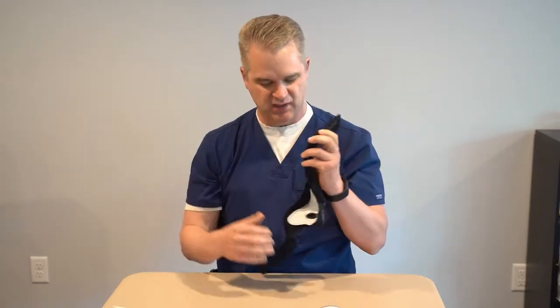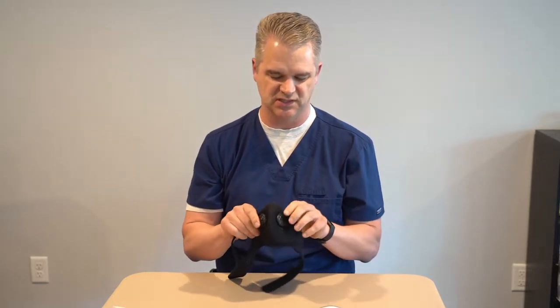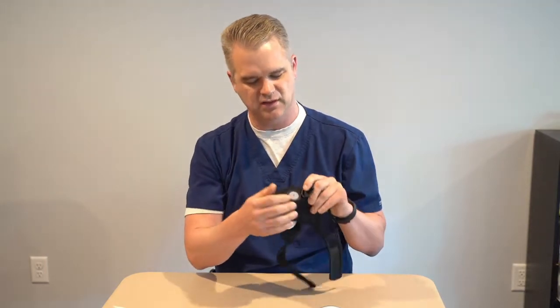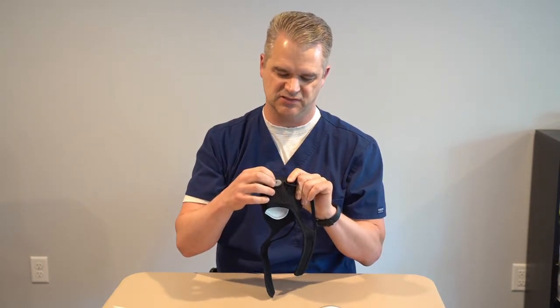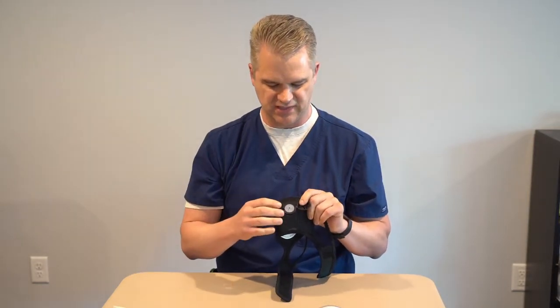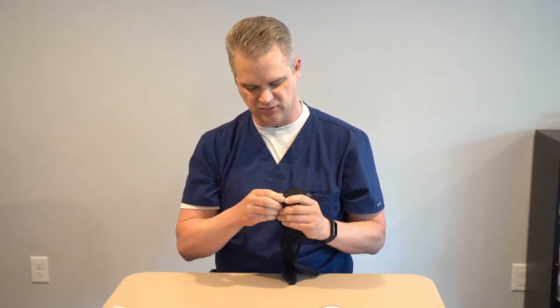is perfectly protective of me from a mouth standpoint, but anytime I breathe out, there is nothing blocking the flow of everything that I am exhaling. Meaning that these are not good in the particular situation of viruses. They have little mask valves, and I'll see if I can open it here. The mask valve has just a little plastic spacer that has absolutely nothing between your mouth and the outside world when you exhale. The problem with these is they are not good for healthcare.